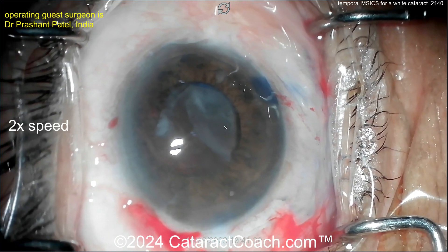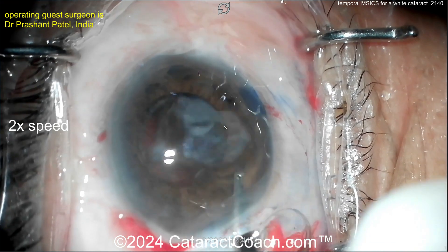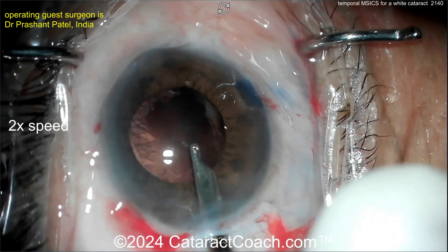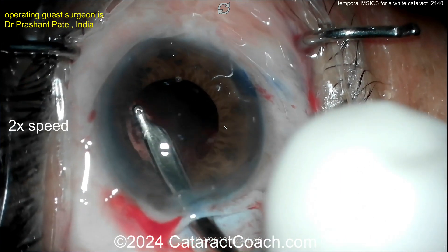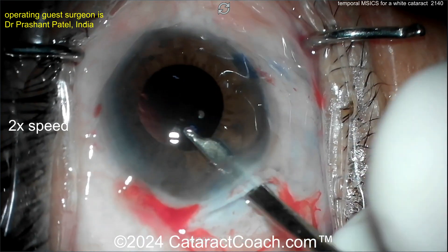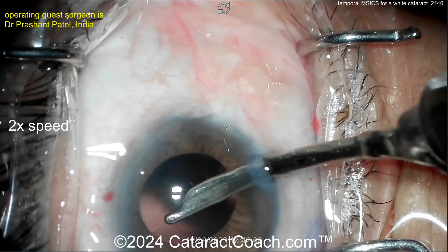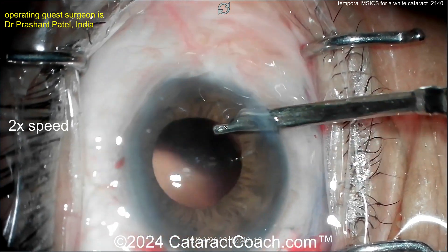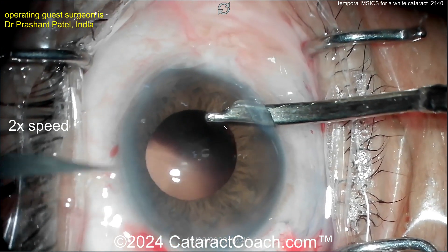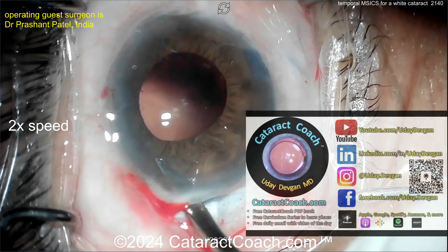MSICS is a beautiful procedure — you need to know how to do it, and it's not that difficult. The key is: first, a good trapezoid incision; second, a big generous capsulorhexis; third, getting that lens out of the bag and above the iris; and finally, delivering that lens through a sufficiently large opening. Now the Simcoe cannula going in to clean up the cortex — beautiful. This patient is going to have a very nice outcome.